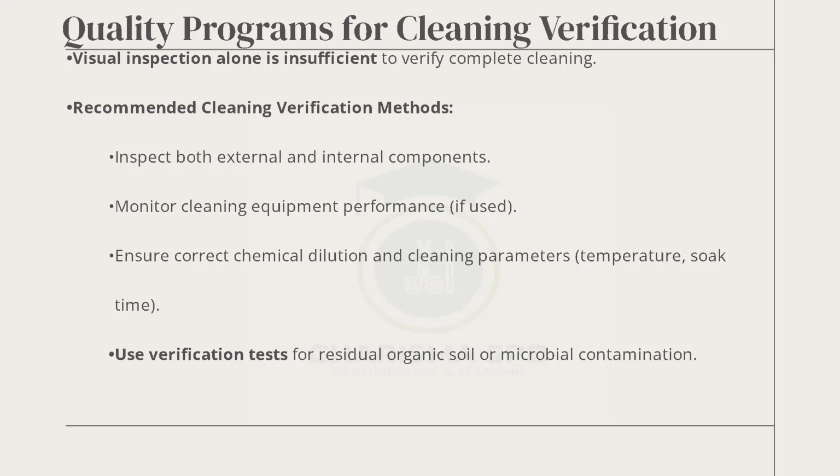When you dip the test strip inside the collected specimen of the solution, you leave it for, depending on what the IFU says, most of the time 60 seconds, which is 1 minute. After 1 minute, you look at the test strip and compare it with the chart. If it does not have the color that says fail, it means it passed. If it has the color that says fail, it means that it was not properly cleaned. So it has to be taken back to the decontamination person to do their part of the bargain. Next slide.